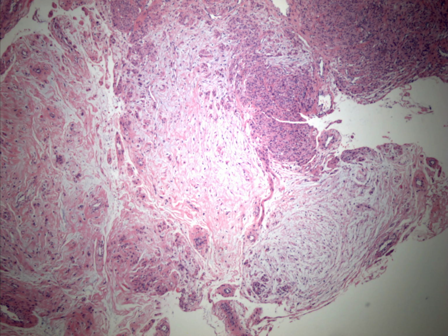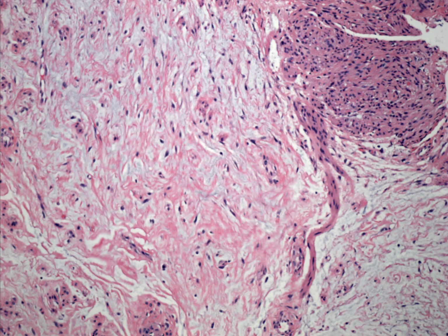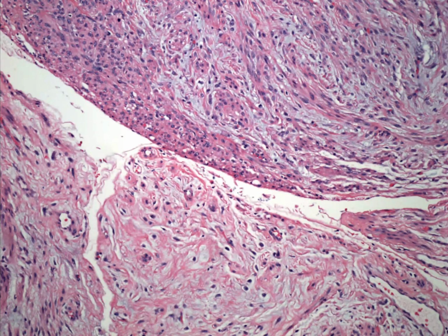On permanent section, some of the areas of the mass showed what I would consider pretty banal histology, with sort of alternating areas between more loose and more dense or cellular areas. On higher power, you can see that the cytomorphology of those spindled cells is pretty benign looking. The nuclei are small. I don't see necrosis here. I don't see mitotic activity. I don't see what I would consider significant nuclear atypia.